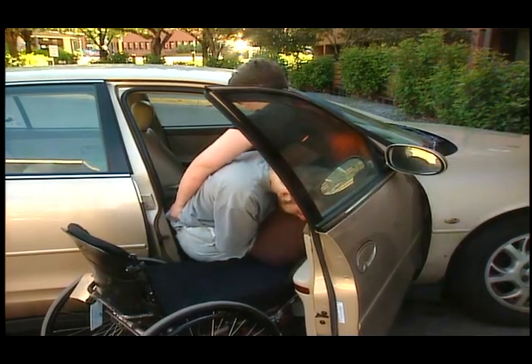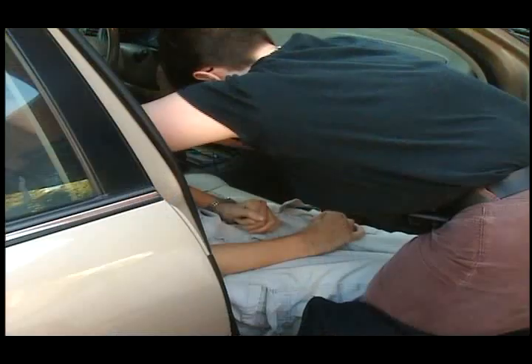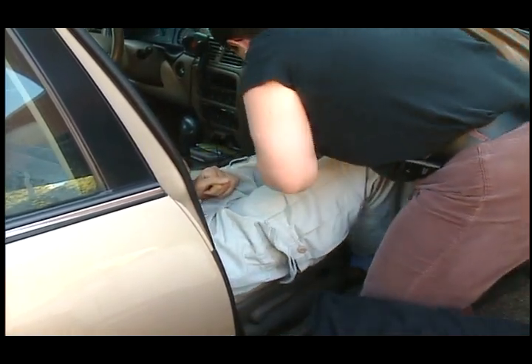The same dependent transfer technique can be used for a chair-to-car transfer, though it can be more difficult to perform because of the wider gap between surfaces. Notice that despite more limited space, the therapist continues to reposition herself in an effort to perform the transfer correctly and reduce the chance for injury to herself and the patient.